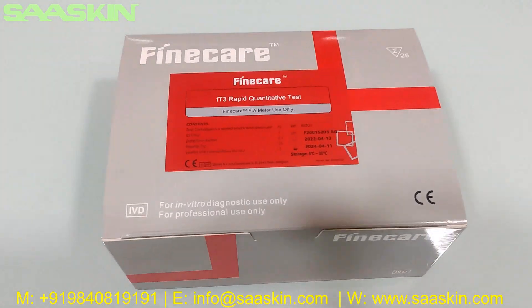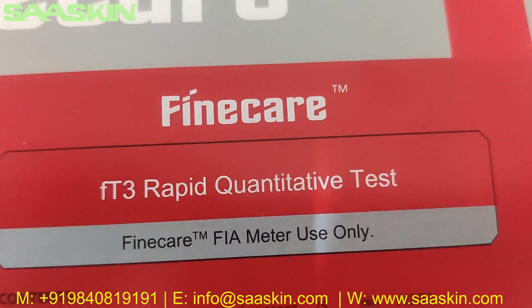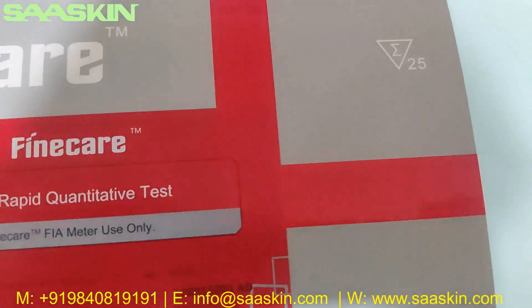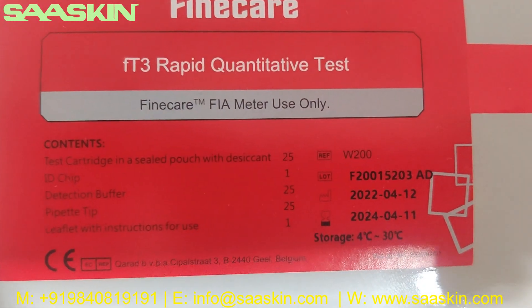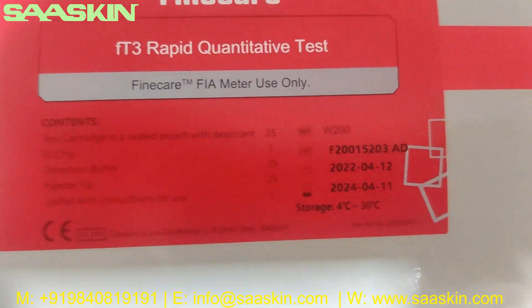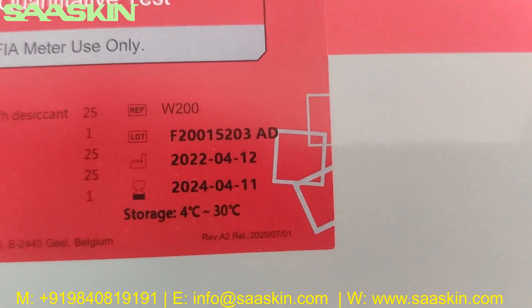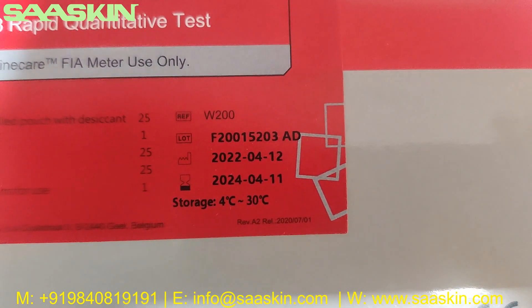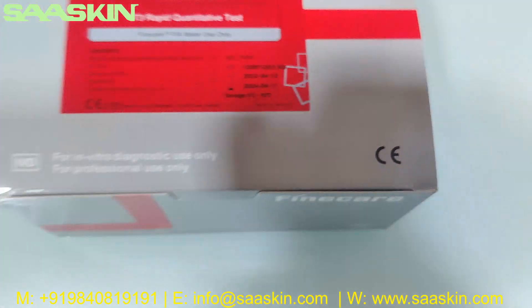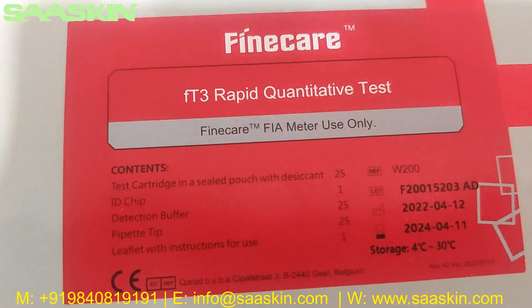Hello everybody, today we're going to see the unboxing of the Fine Care FT3 Rapid Quantitative Test. This is a 25-test kit pack and this test kit is supposed to be used only with the Fine Care systems. You can see the reference part number, and also the lot number, manufacturing date, expiry date, and storage temperature conditions. This is a CE-certified product.